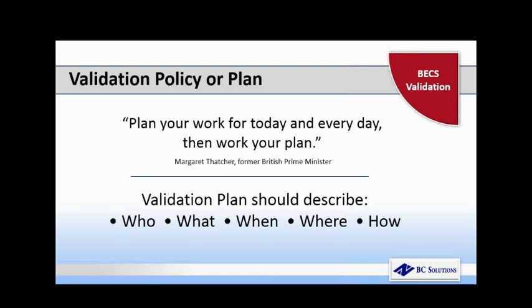One other question that I want to address is you need to describe in your validation policy or plan where the validation documentation will be stored. There needs to be more than one person in your facility that knows where you're keeping that final documentation. And so you should state where it is. If the person who has reviewed it and stored it leaves your organization or is no longer associated with your organization, someone else needs to be able to get to those documents in case you have an inspection.